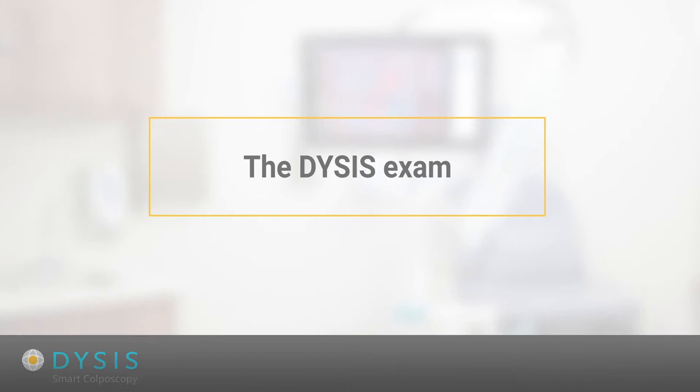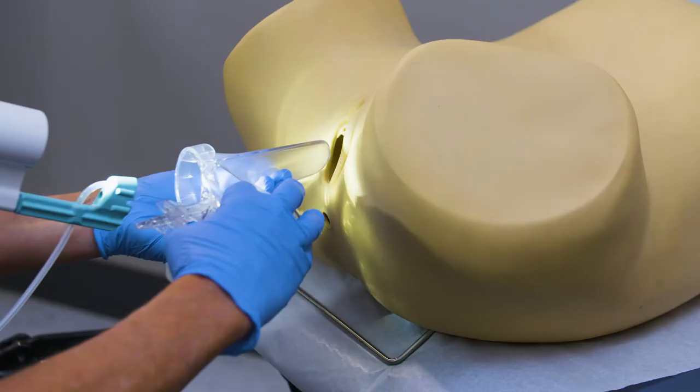The Dysys Exam. The provider will select the Dysys exam button to turn on the imaging headlight in order to insert the speculum.